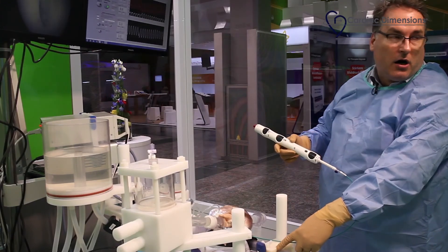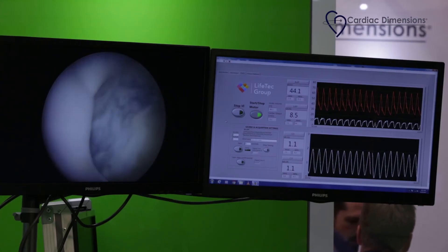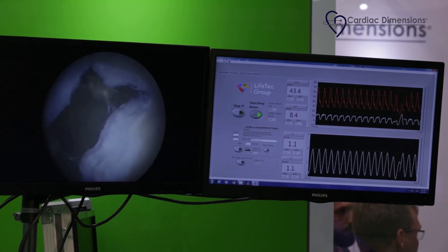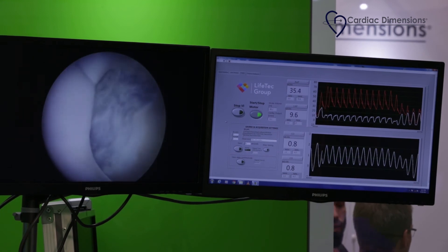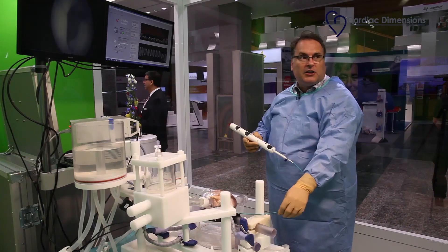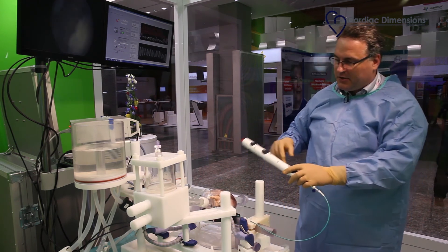You can nicely see in this new model the hemodynamic effects of a cinching of the annulus of the mitral valve — giving way back again, pathology and healthy situation just by pulling about one centimeter only.